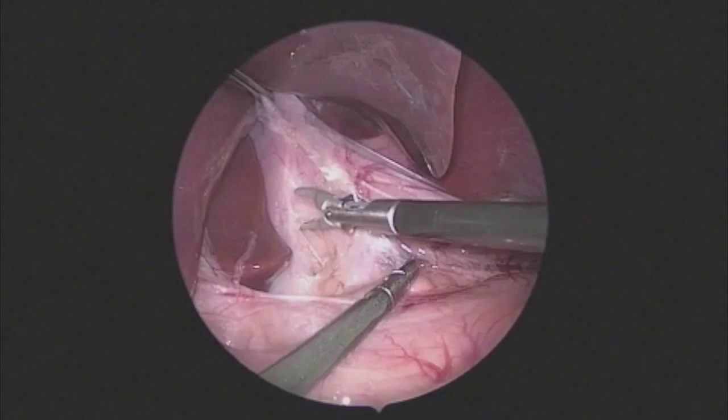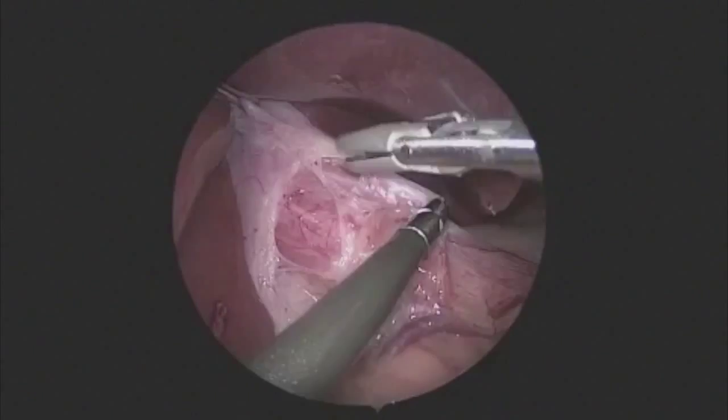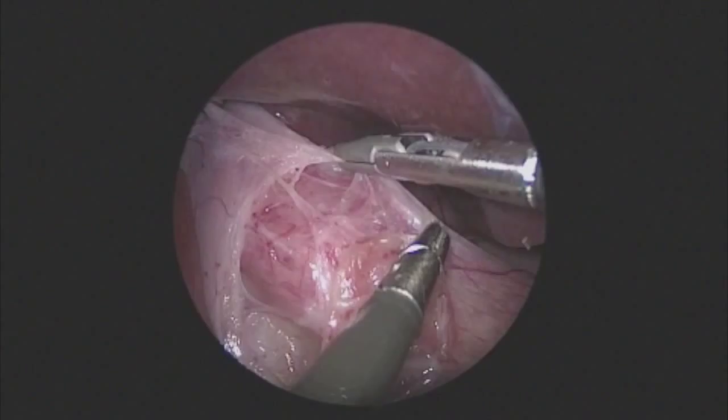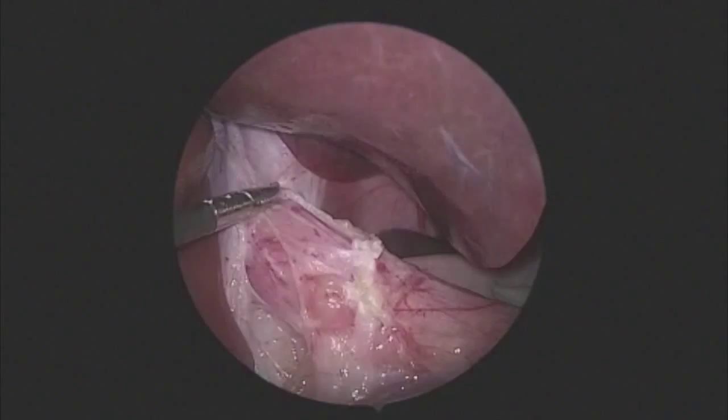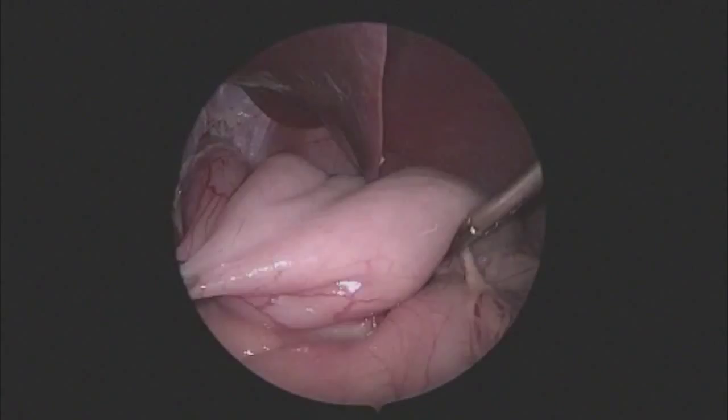The right crus is then exposed. Care is taken not to dissect up into the hiatus, as this increases the risk of hiatal hernia, but it is important to identify the esophagus, especially the anterior portion, so that a good length of intra-abdominal esophagus has been established and that the wrap is above the GE junction. Using the tips of the sealer to seal these tissues and then gently tear them is an atraumatic and very hemostatic way to do this.